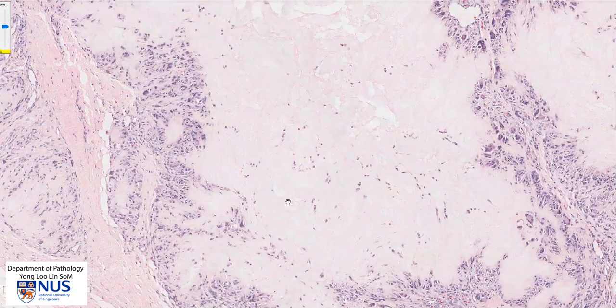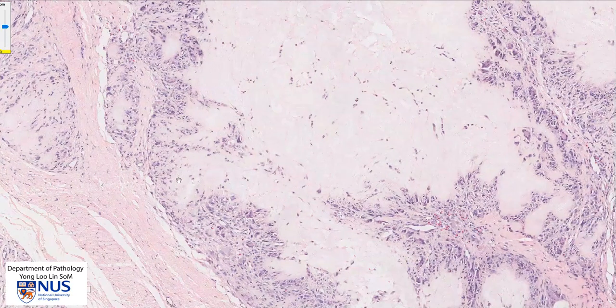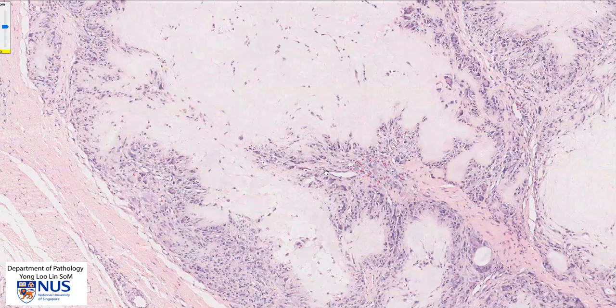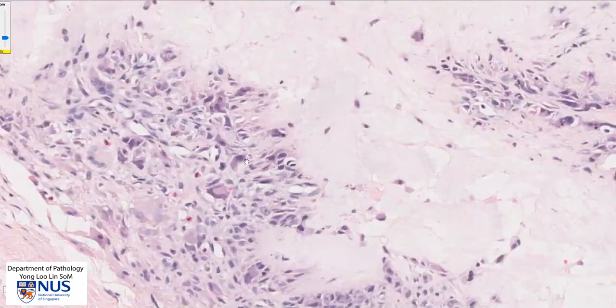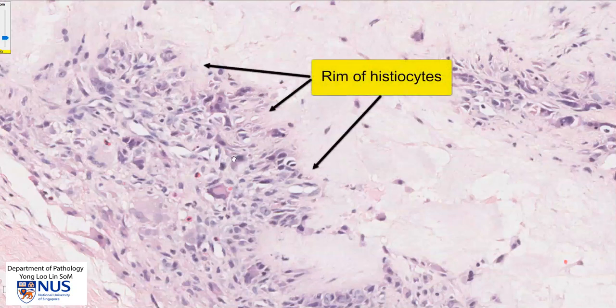We do see the very characteristic histiocytic reaction that rims these areas of amorphous pink deposits. Let's take a closer look at the edges. There are many histiocytes or macrophages, and we can see them here of varying shapes.